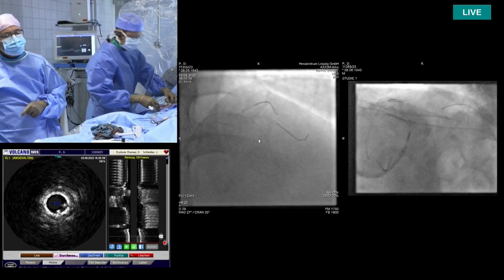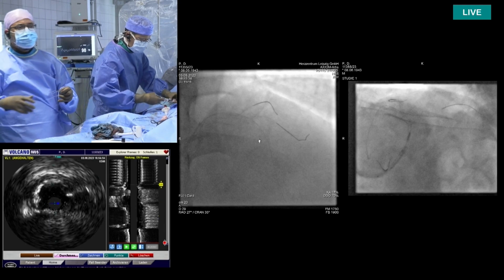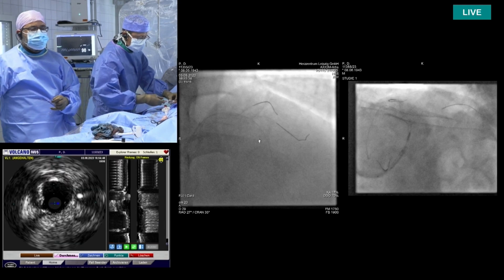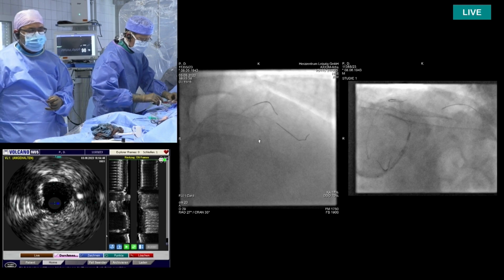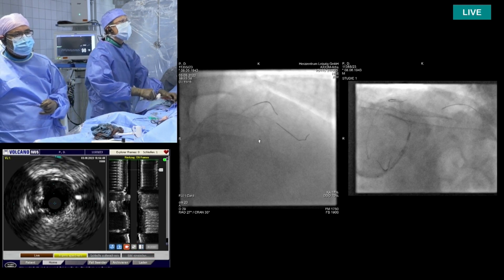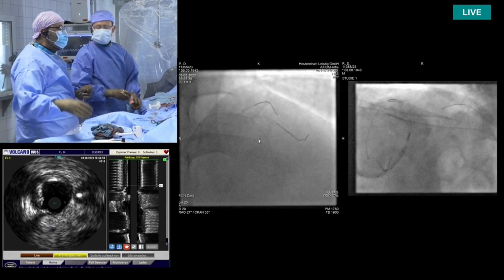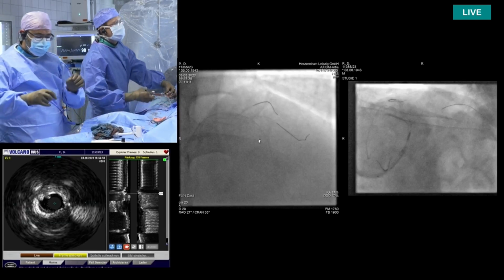Yeah, so some cracks, not a lot, but definitely we cracked the lesion at some points. There's no calcified nodule. I was actually more or less satisfied with the balloon expansion. To tell you the truth, I would proceed with stenting. I would proceed here, stent, yes. Me too, unless you give us a very big objection.